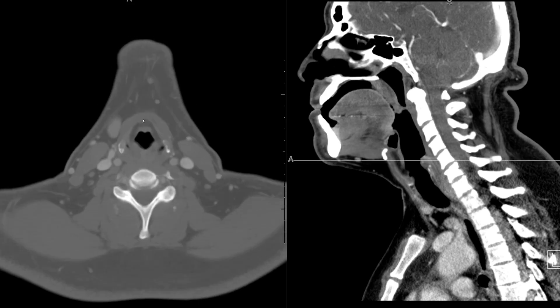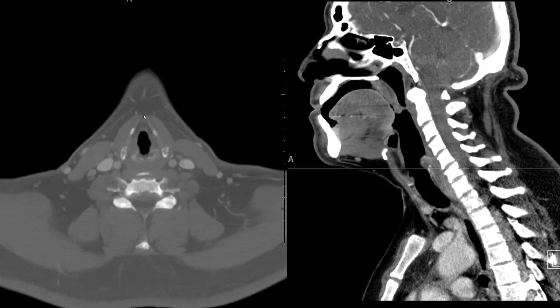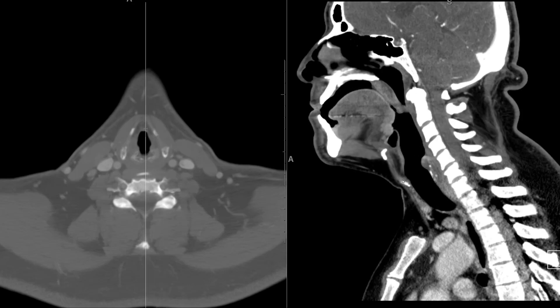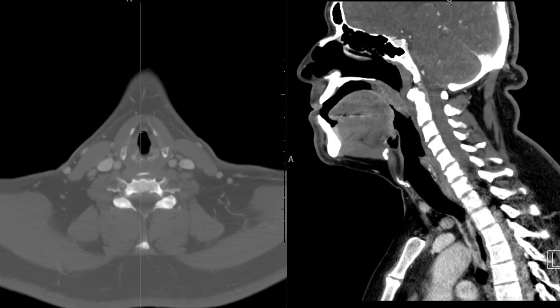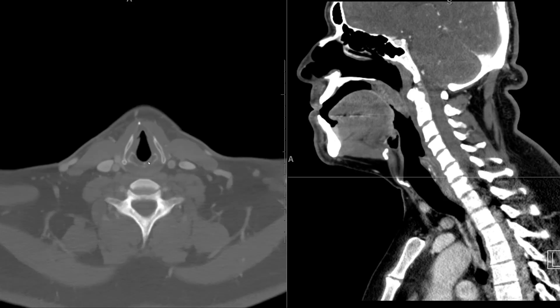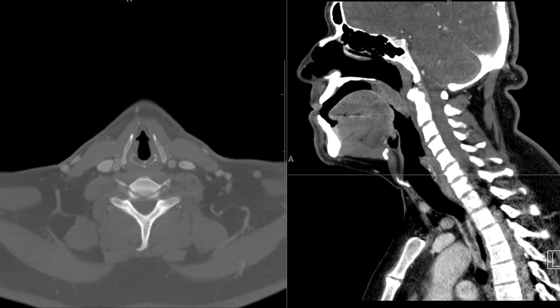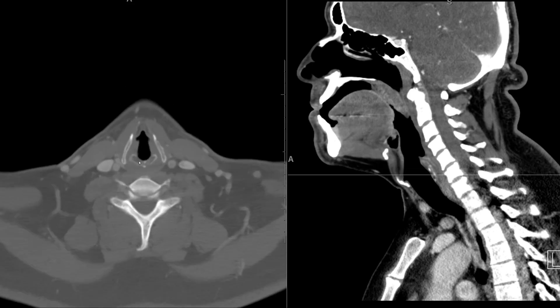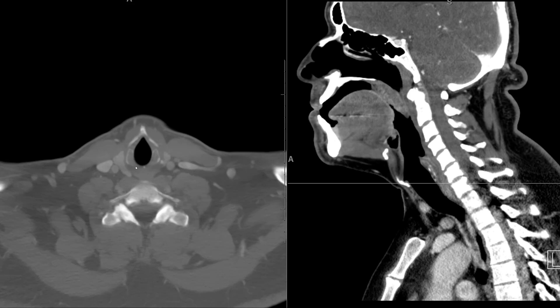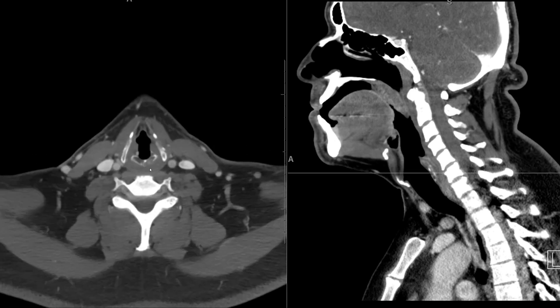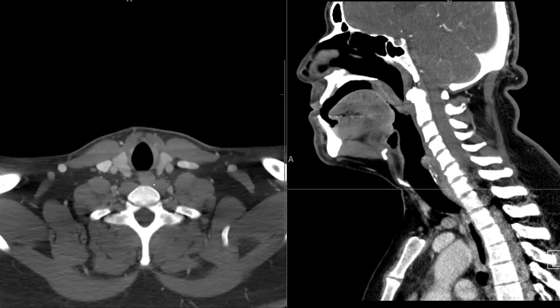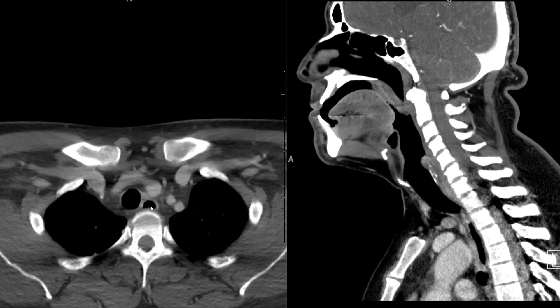As you continue down, you run into the thyroid cartilage — the right and left aspects of it. Here is the thyroid cartilage on the sagittal view. Posterior to the thyroid cartilage is the cricoid cartilage — here's the major cricoid cartilage. It has smaller cartilages attached to it, like the arytenoids. I just want you to identify the larger cricoid cartilage here in the back. The hypopharynx continues down behind the cricoid and enters the esophagus, which is here, partially gas-filled.